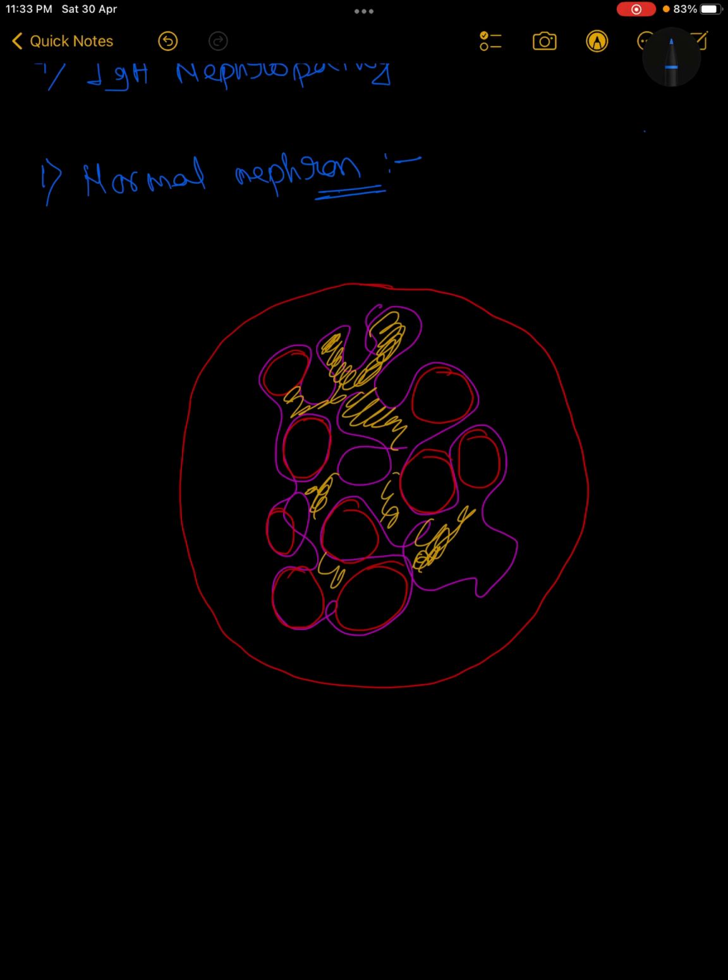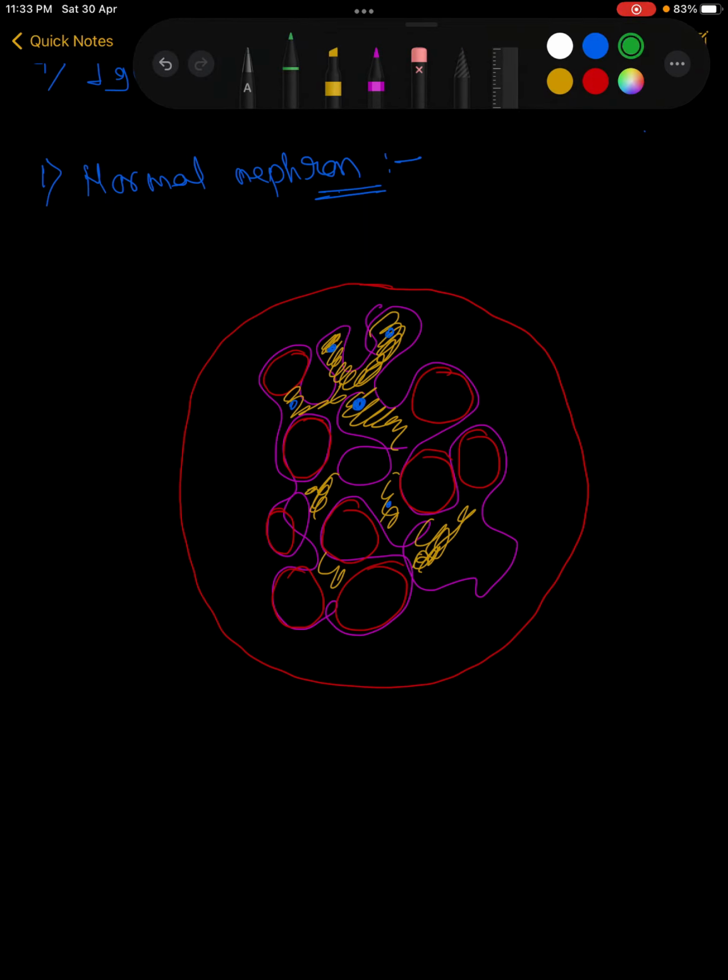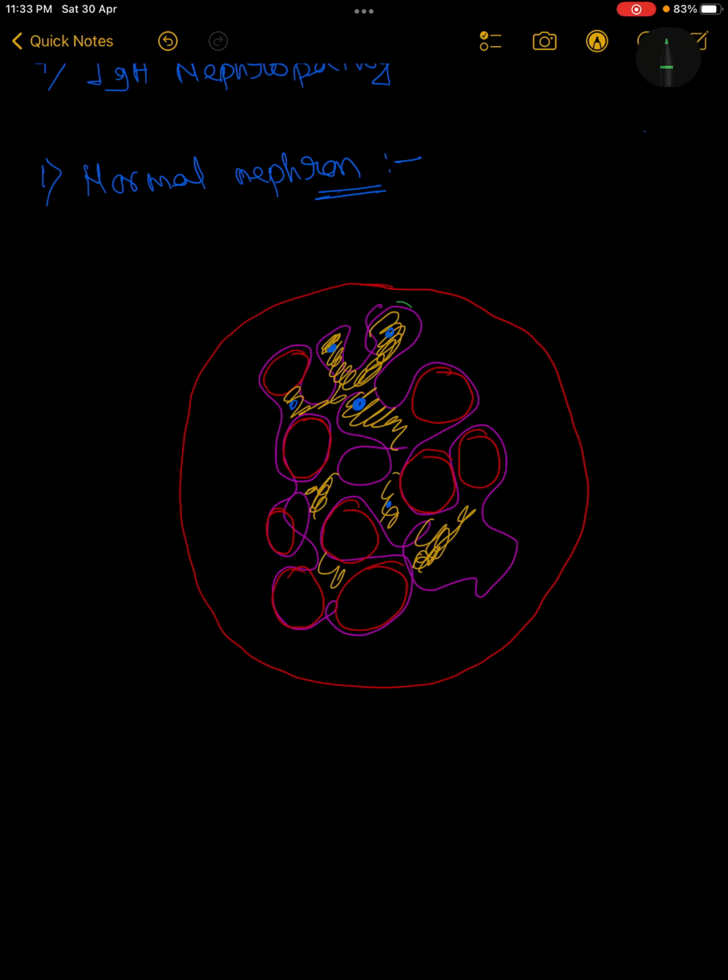So now let's think about this as one nucleus of mesangial cells. Okay, and podocyte. So where is this podocyte present, by the way? Podocytes, or the visceral epithelium, adhere like this, and you will see a peripheral nucleus.